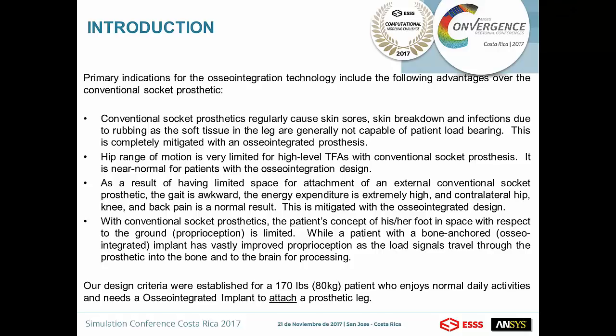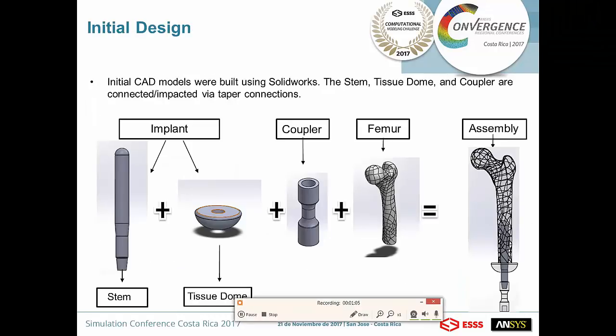So we're going to design a transfemoral implant for a 170 pounds patient. So this implant should be able to support this patient's daily activities. So first, what we did was to design the implant and the coupler that is going to attach the implant into the prosthetic leg using a CAD tool. In this case, it was SolidWorks.